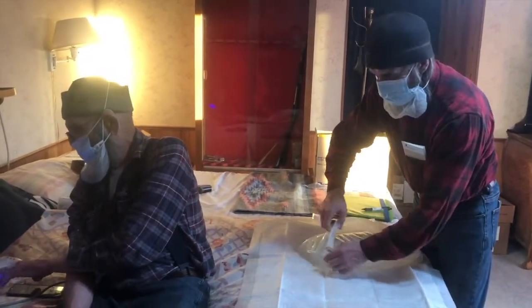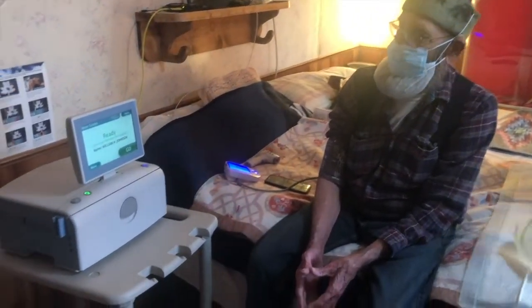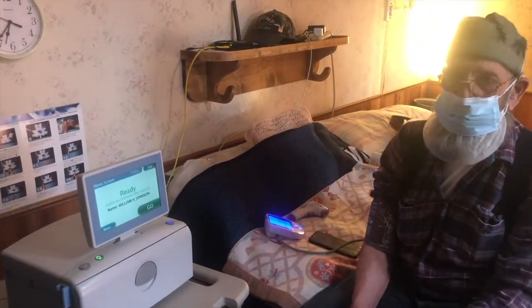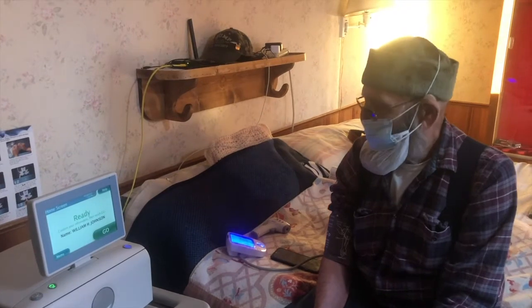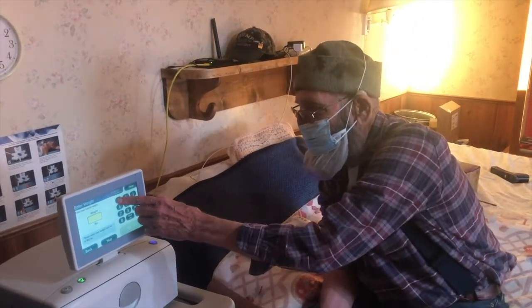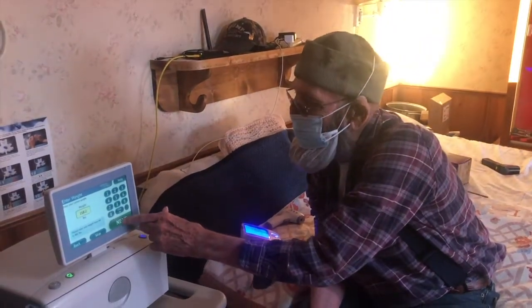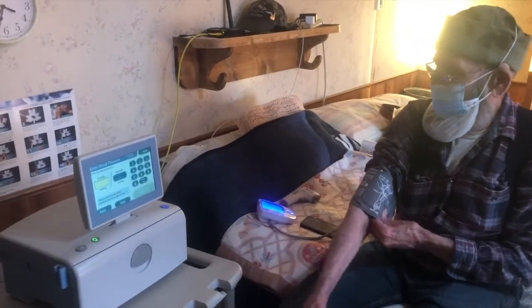155 over 101. Let's try that again. This thing makes you verify your name. This machine is specifically set up for me. It has all my information in it. It has a modem in there that sends all that information into town immediately as we do this. Enter your current weight. 158.2. Enter your blood pressure. That's still high. I'm going to try it on the other side.